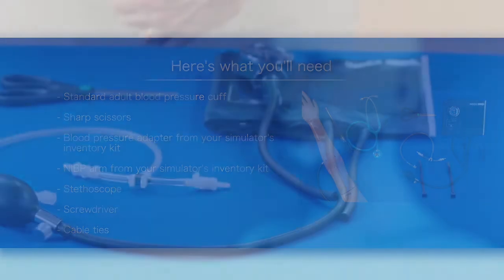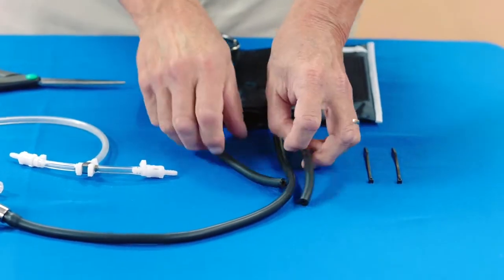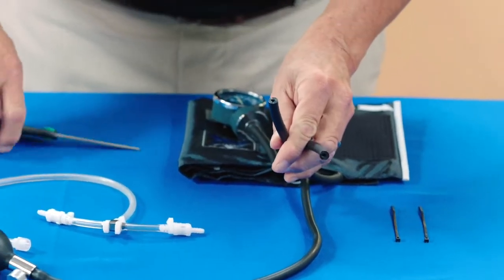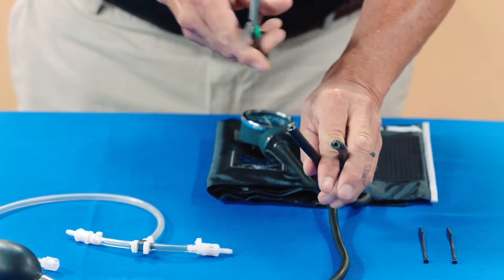You can take your simulator's blood pressure using non-invasive monitoring techniques, but you will need to modify a standard blood pressure cuff. Cut the tubing attached to the gauge approximately 9 cm from the cuff.